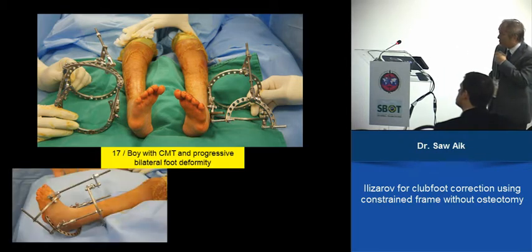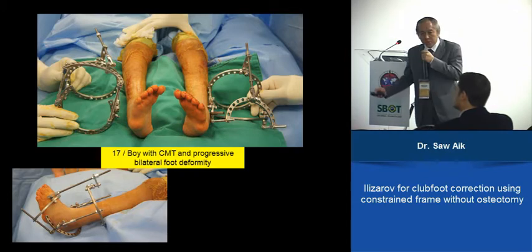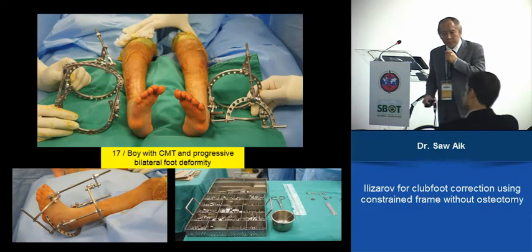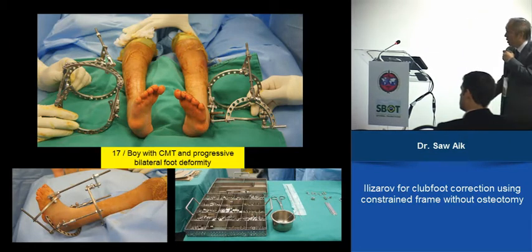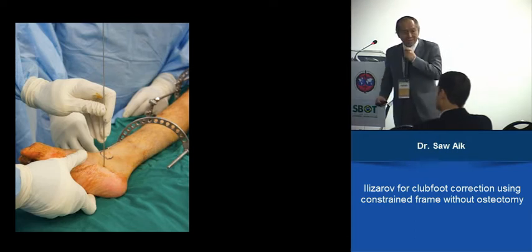We did this on both sides, constructing the frame. Once the frame is constructed, the hardware needed is very little — two wires over the calcaneum, two wires over the metatarsus, and a few half-pins over the tibia. That's all — it's quite a fast procedure. Here again, using a finger to push it in; this is a bit harder at 17 years old, but you can do that.